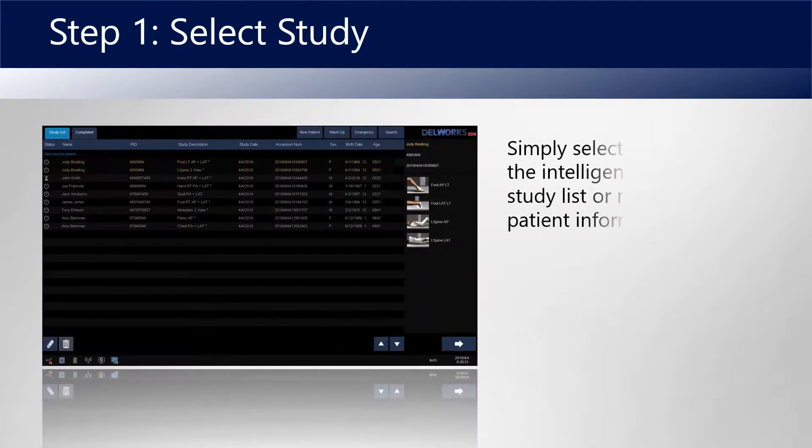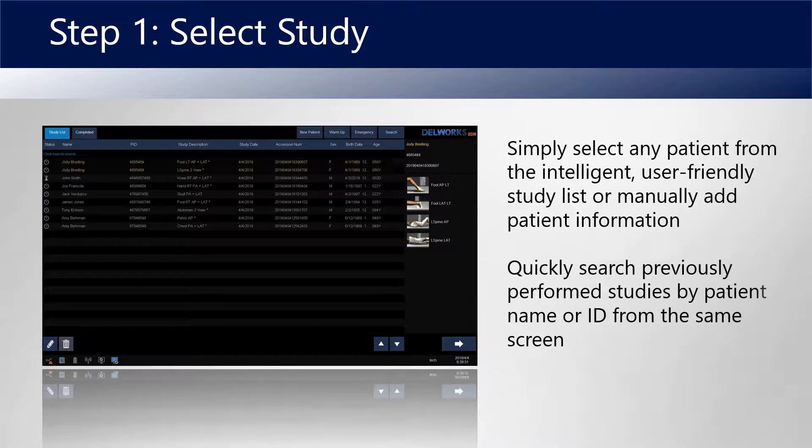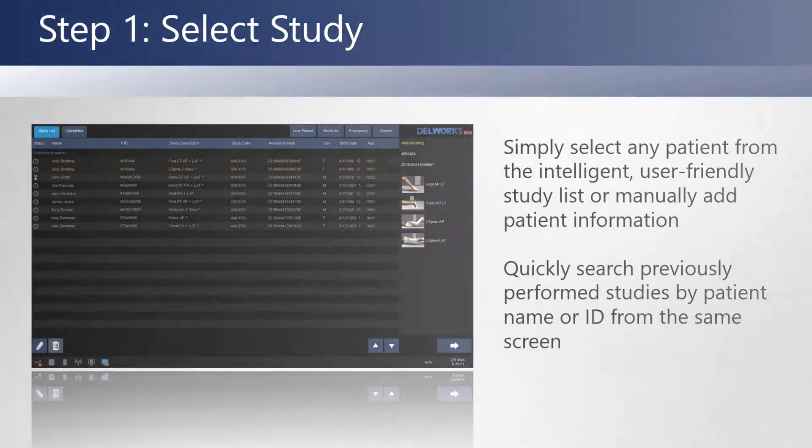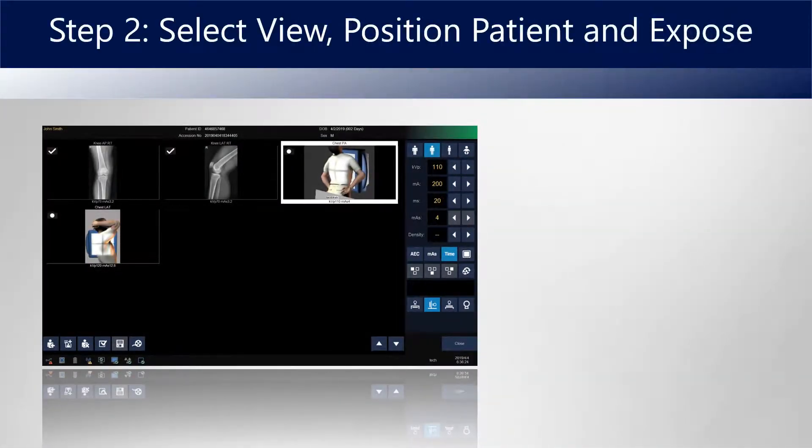First, simply select your patient from the study list. You can also search previously performed studies with the patient's name or ID. The next step is to select the view, position the patient, and make your exposure.